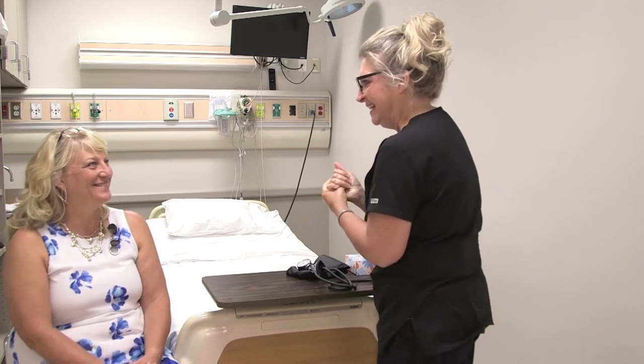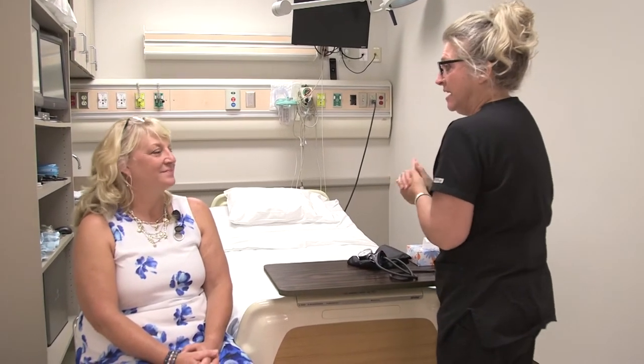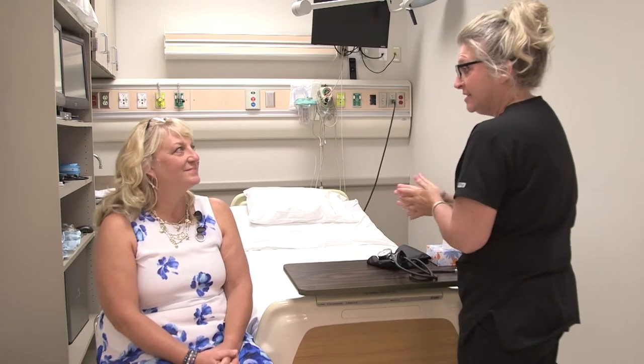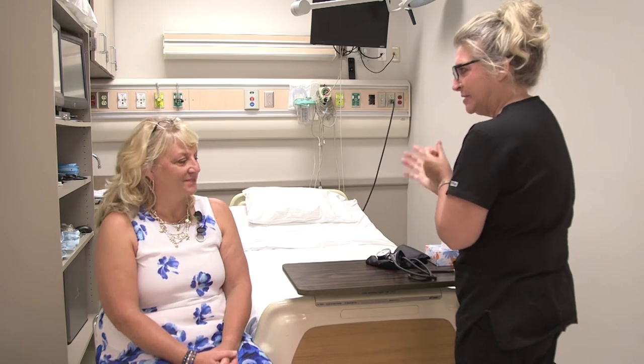Good morning. Hi, how are you? Good. I'm just going to wash my hands here real quick. My name is Mary and I am a student nurse at Chippewa Valley Technical College and I'm going to be taking your blood pressure today.